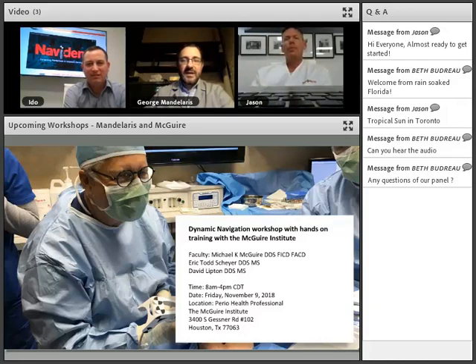I absolutely do. As much as I love you guys, and I think you've made great strides, the head tracker, I feel, is a bit obtrusive. It's easy to hit. So I see myself probably in the future, as long as you're aware of the head tracker and you're not hitting it, you're in good shape. But if the circumstances are maybe more applicable to using the jaw tracker, it's simple to attach, and I will be using that. So I think it depends on the operator's preference.